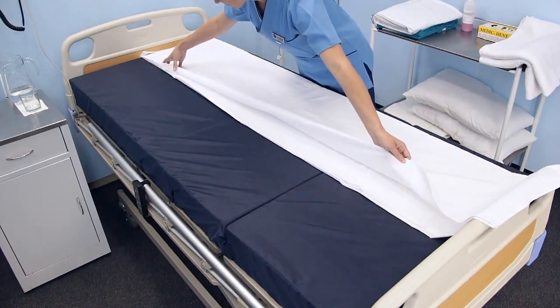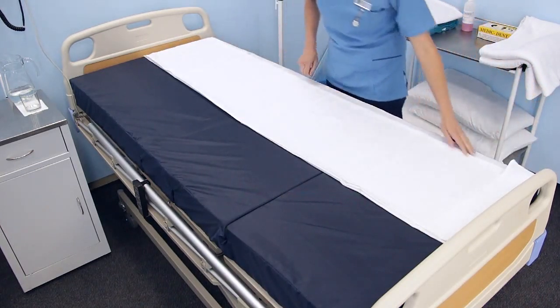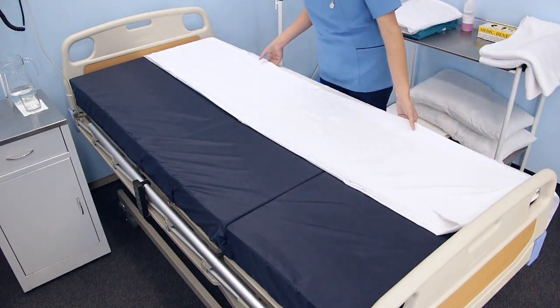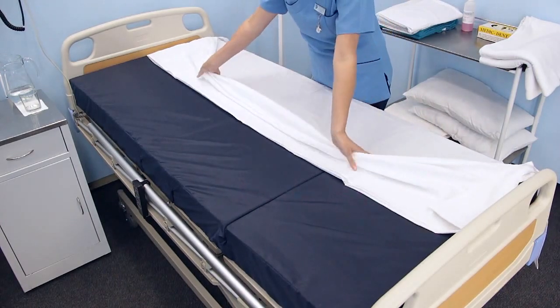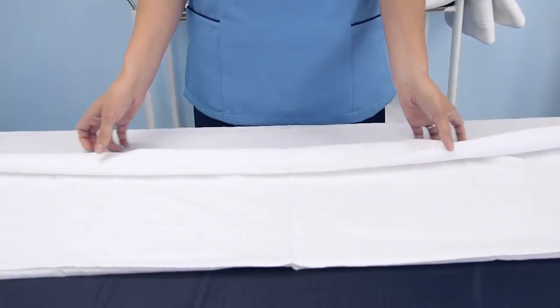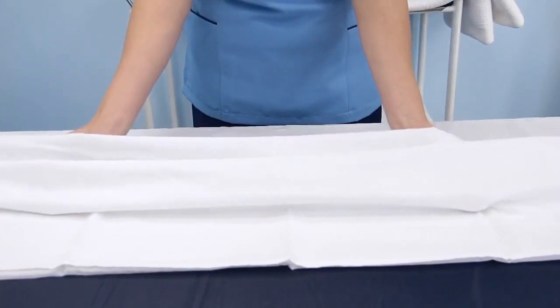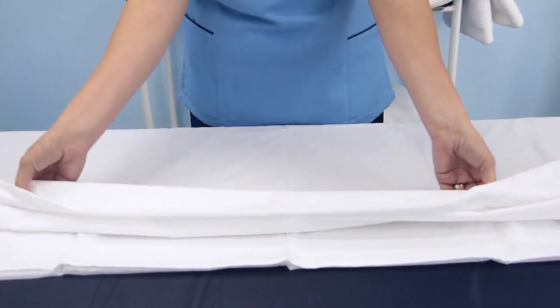Open the long side of the sheet towards you and let it hang over the edge of the mattress. Fan fold the other half of the sheet to the center of the bed. Before we go any further, I will briefly discuss how to fan fold. Grasp the long side of the linen with both hands. Fold the linen about 5 centimeters inwards, away from you, and then under and above.